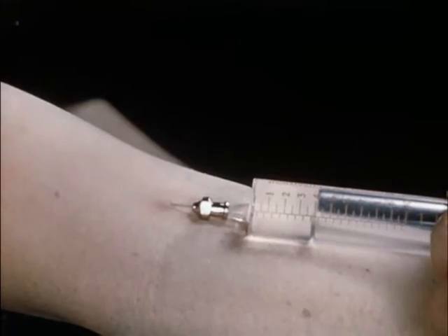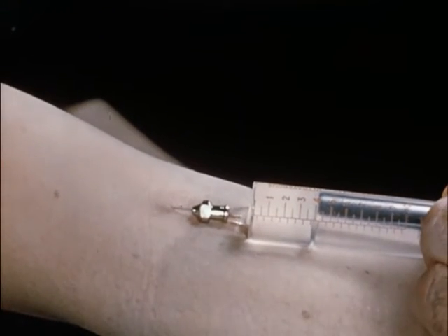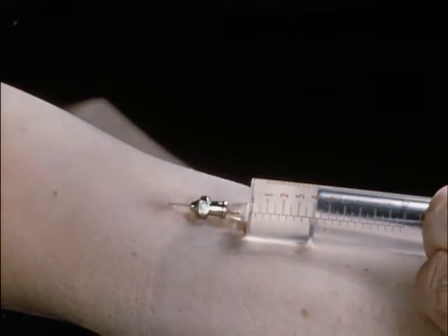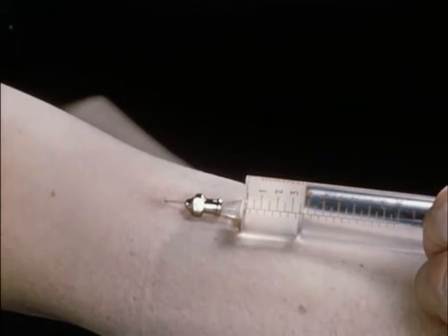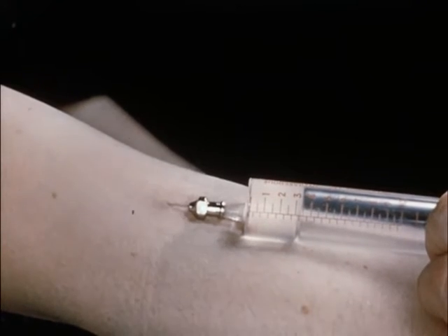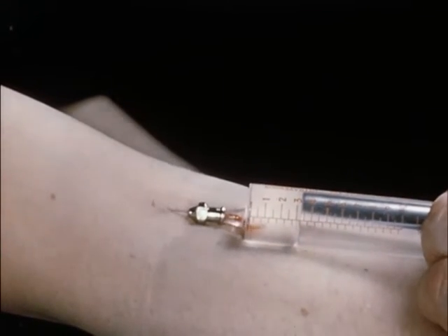The film is for those with little previous experience of the method. It does not deal with prolonged administration, the injection of veins not superficial and palpable, or any technique more suitably within the province of the skilled general anaesthetist.